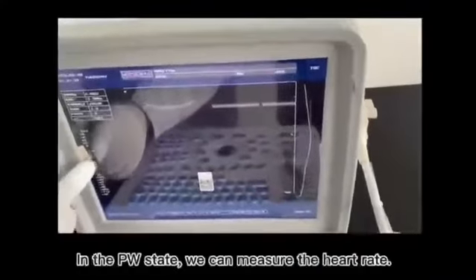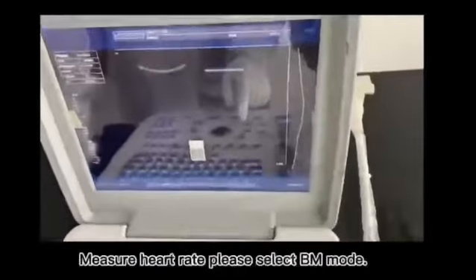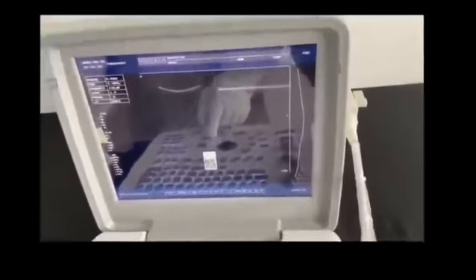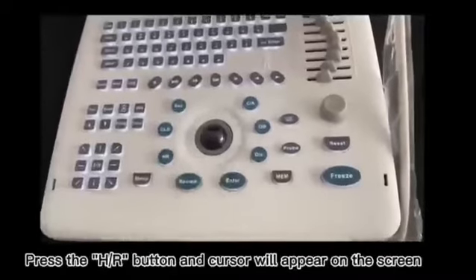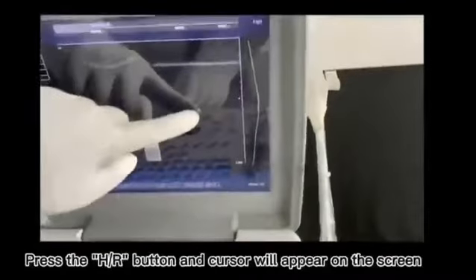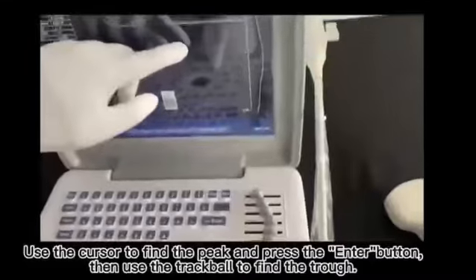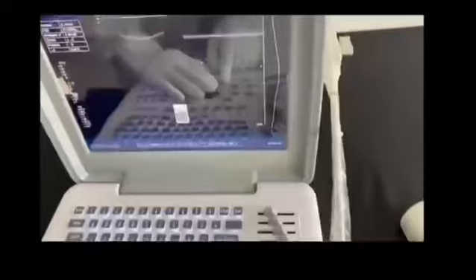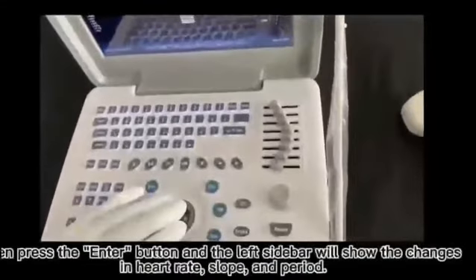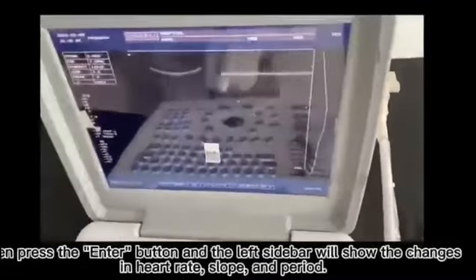In the PW state, we can measure the heart rate. To measure heart rate, please select BM mode. Press the H/R button and a cursor will appear on the screen. Use the cursor to find the peak and press the Enter button, then use the trackball to find the trough. Then press the Enter button and the left sidebar will show the changes in heart rate, slope, and period.